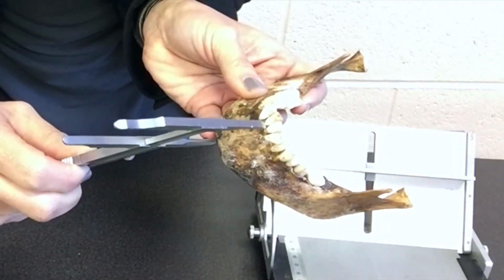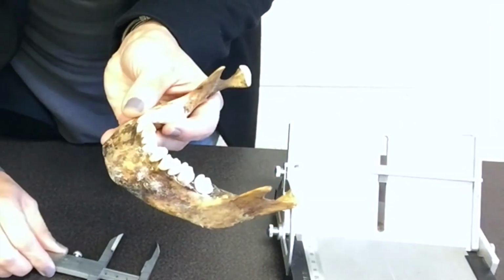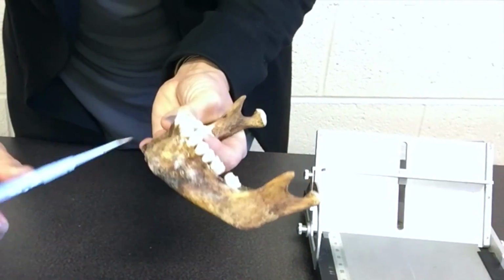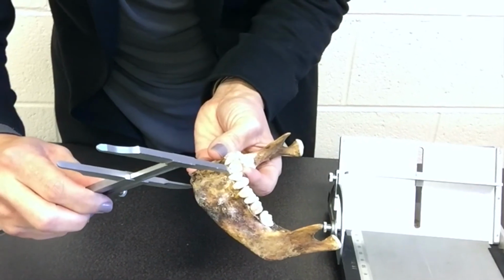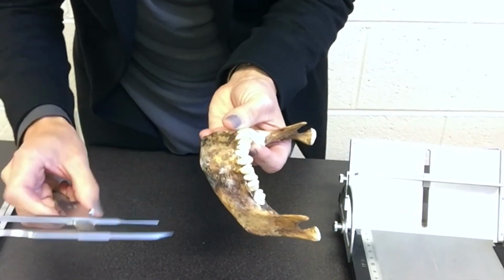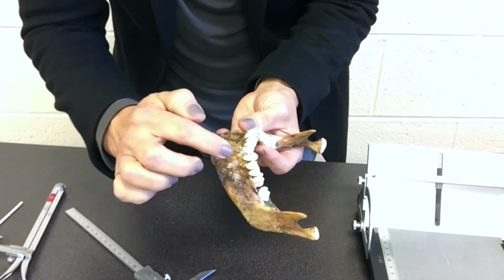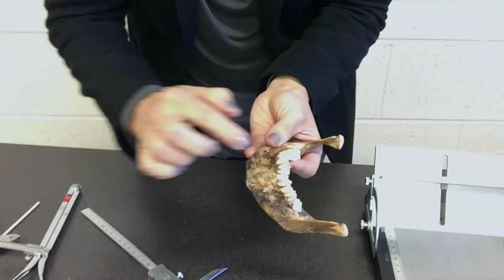Now, if the alveolar border between the central incisors is damaged, you can use the same position, approximated between the lateral incisors. If you do this, just make sure that you indicate it on the recording form. And if there is significant resorption of the alveolar process, then this measurement shouldn't be recorded.